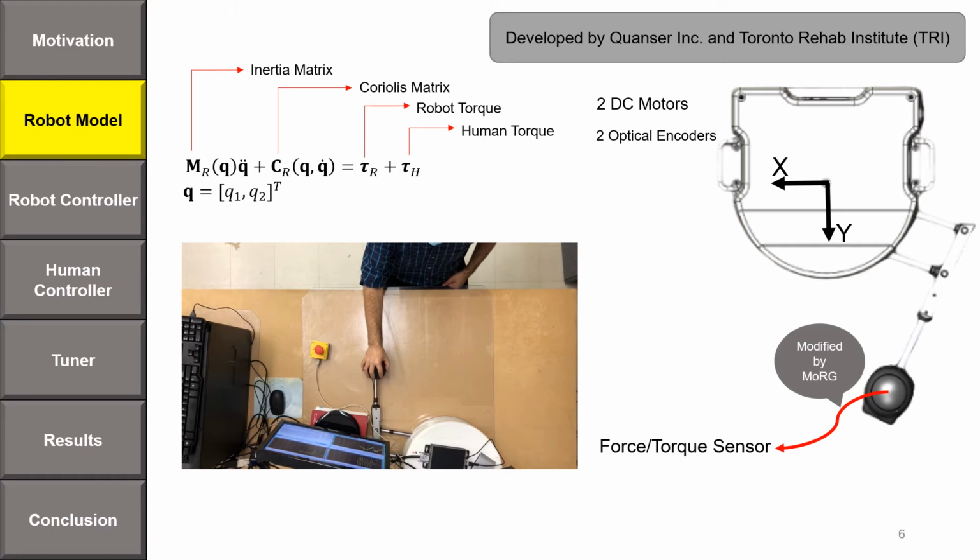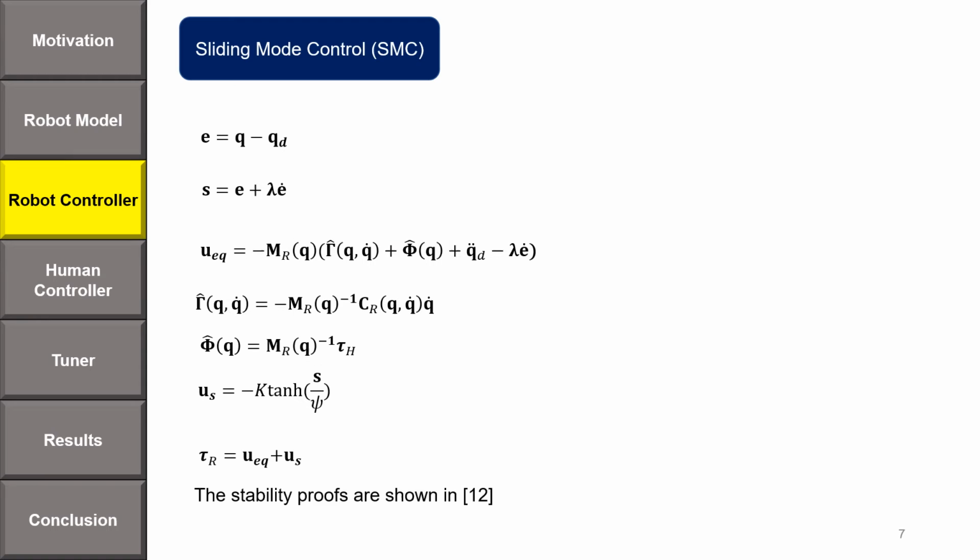The governing equations of motion are obtained by Lagrange method and are coded in MATLAB 2021. Because of the planar structure of the robot, the equations only include inertia and Coriolis terms and not the gravity term. The human torque is considered as a disturbance term in this equation.